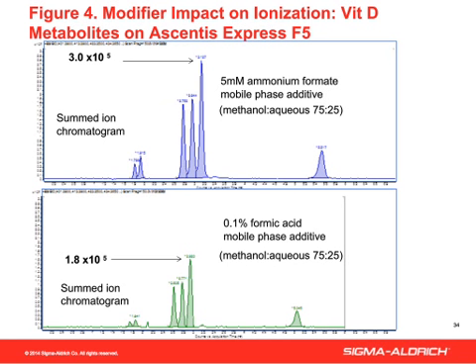There's no ionizable sites on the vitamin D or its metabolites, so we wouldn't anticipate really too much of a selectivity change just based on pH. So we were pretty confident we could keep our resolution. What was surprising was the response difference between the modifiers.